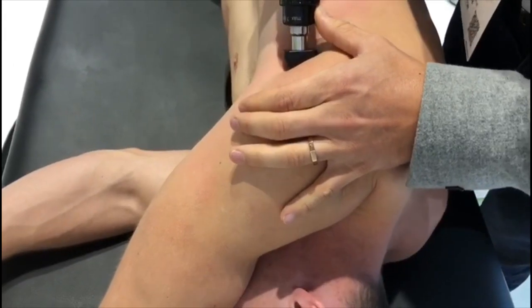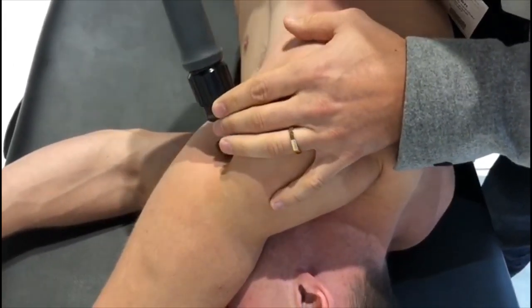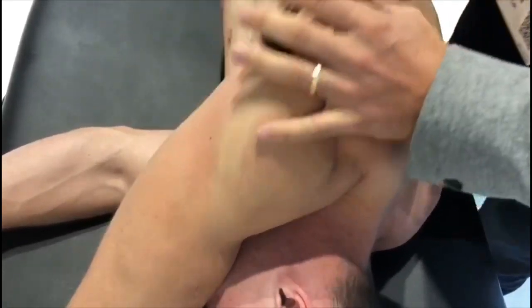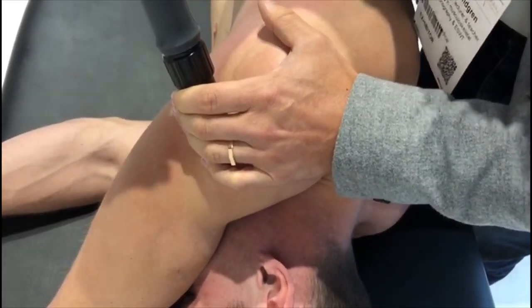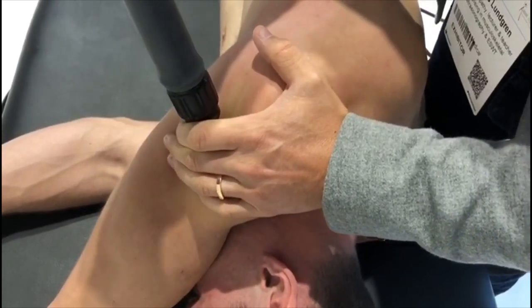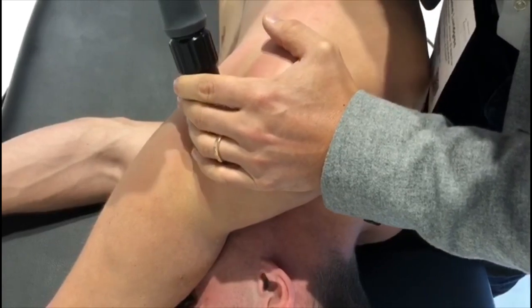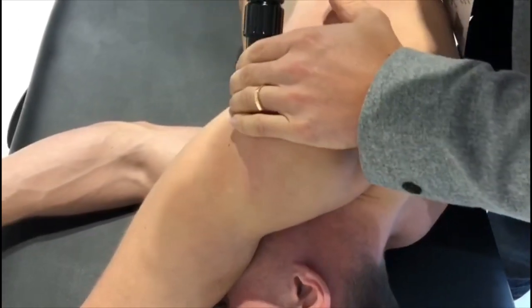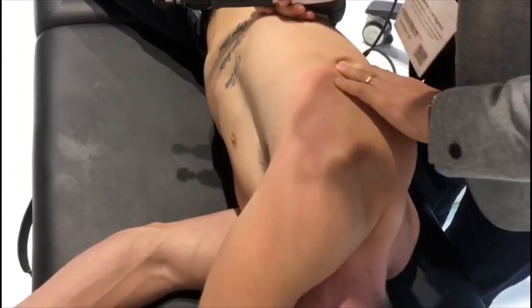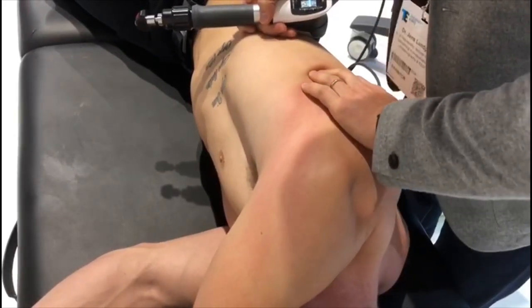Here as well. Yeah, here as well. A little bit here as well. The posterior part of the deltoid muscle, there's a tight fascia as well. Okay, so now it's actually sliding quite a lot easier here. So I think we've got a result in this region. All right. Let's see. If you put your arm like this, just to see what happens. It's a little bit tight here as well.